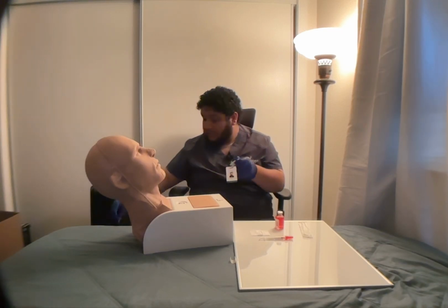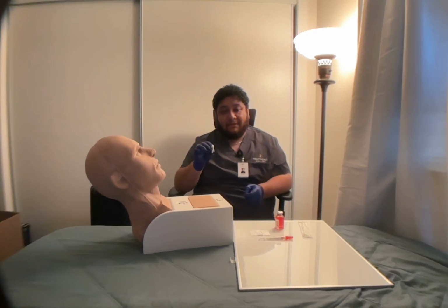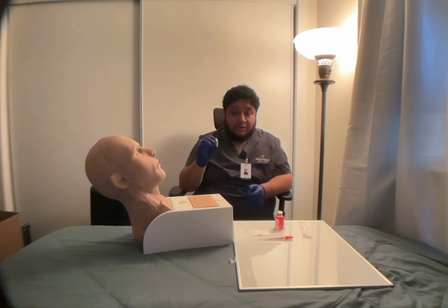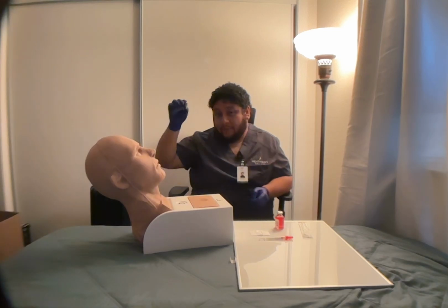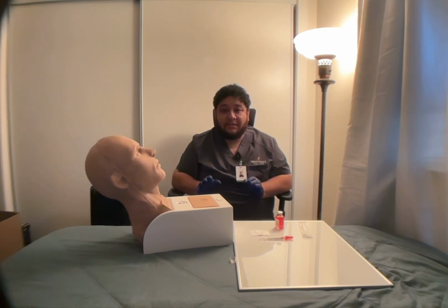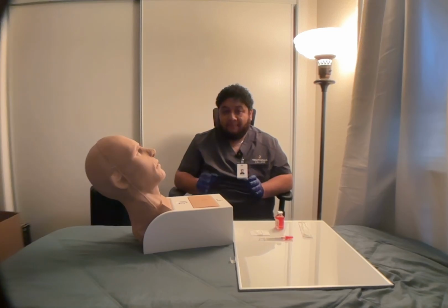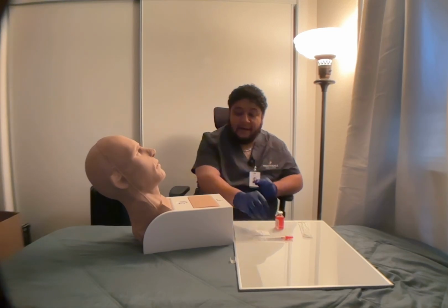Okay, some alcohol swab. Now when I clean the site, I want to clean inwards to outwards 2 inches. Dispose of this. Now I'm going to go ahead and let that air dry. I do not want to touch the site. Now I'm going to go ahead and notify Mr. John that I'm ready to inject. Okay, Mr. John, I'm going to go ahead and inject the medication.